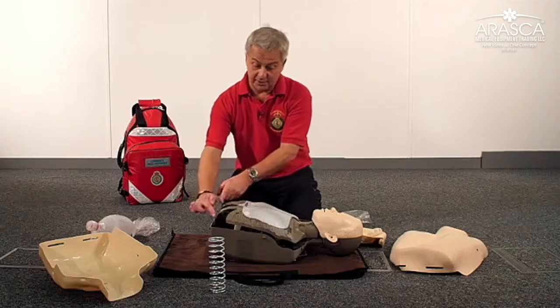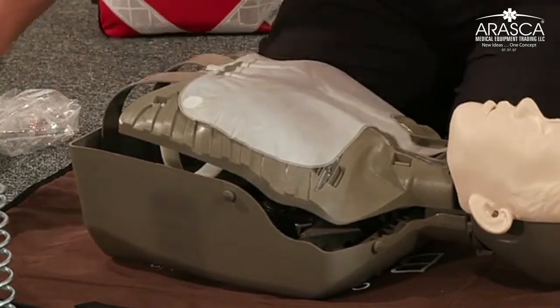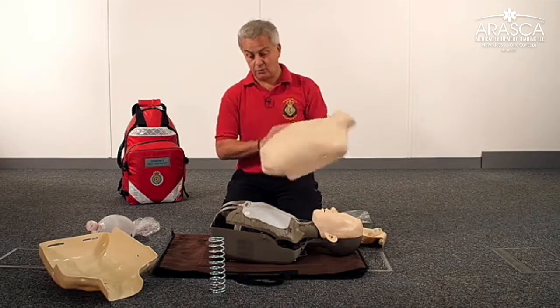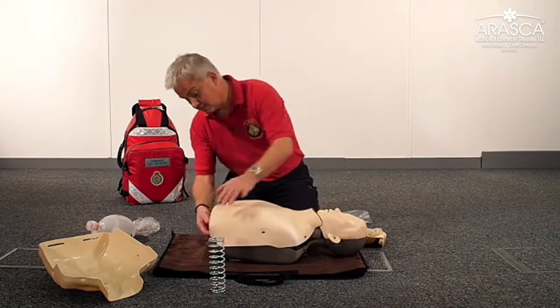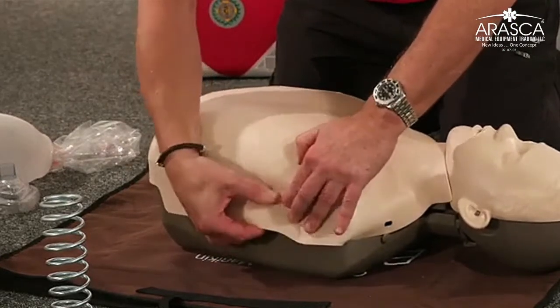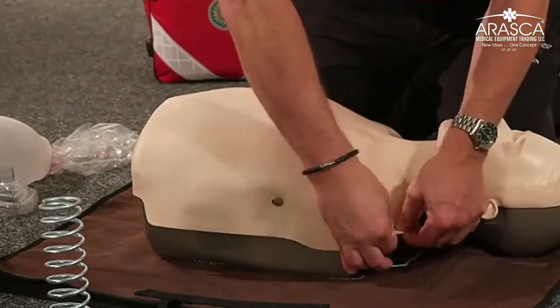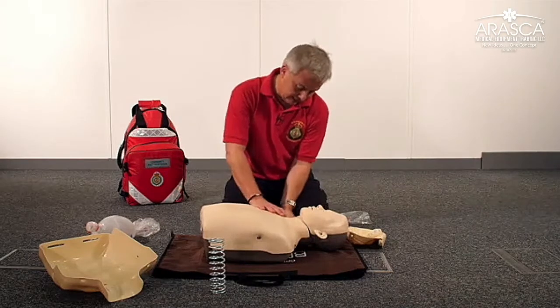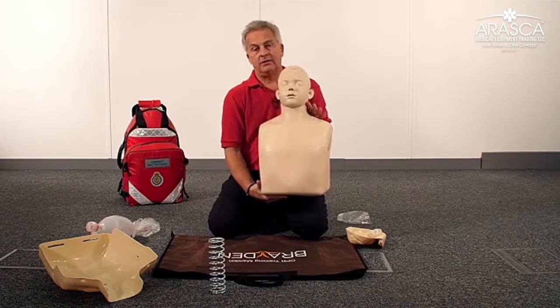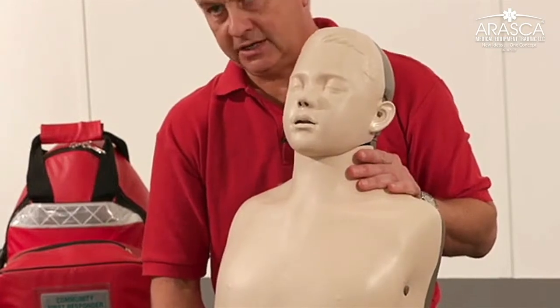It's important that these parts are in the correct slots on the base of the mannequin. Now apply the junior chest piece, which is more representative of a boy, and replace that onto the mannequin. This is something you might want to do whilst your students have gone off for a tea break from their adult BLS training, whilst you convert the mannequin into a junior mannequin. Locate the skin and now you have a mannequin which looks like a 10 to 12 year old boy, ready for your paediatric BLS session.